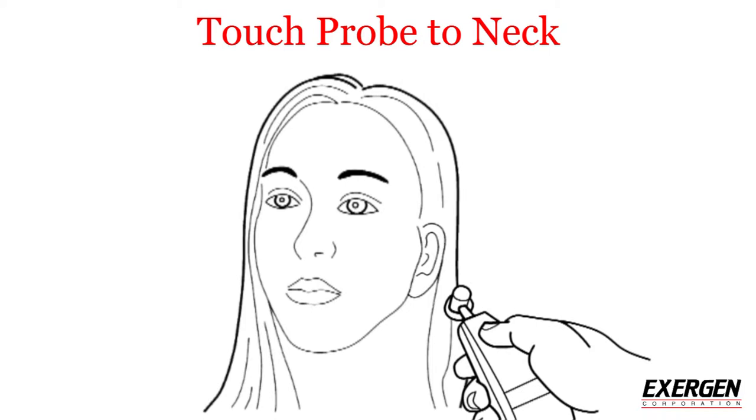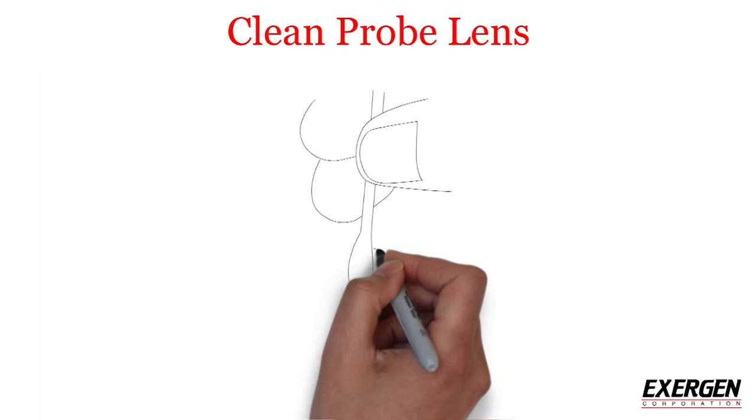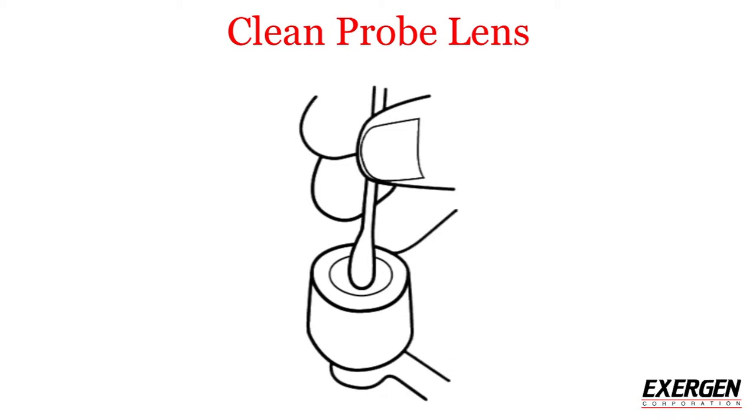With the button still pressed down, lift the probe from the forehead and touch the neck just behind the earlobe. Then lift the scanner off the neck, stop pressing the button, and read and record the temperature.